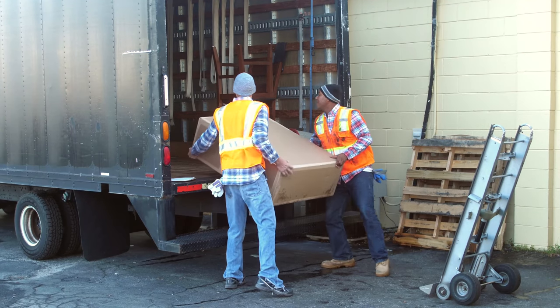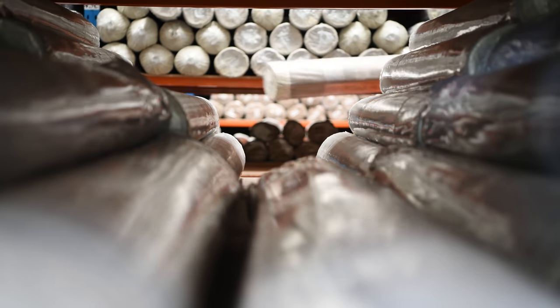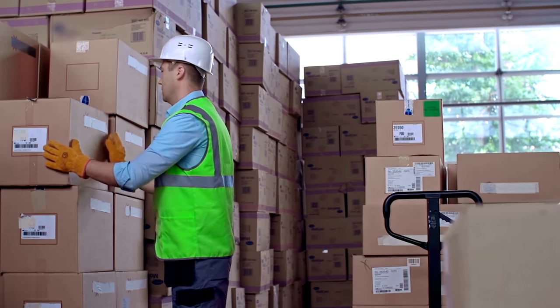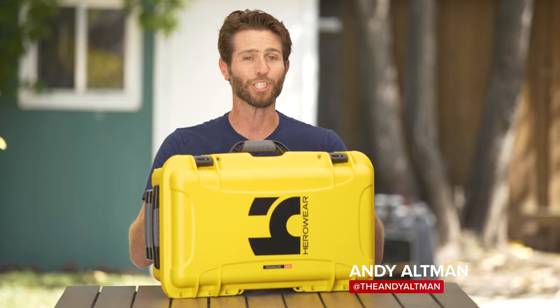If you're over 20 years old, chances are you've had a sore back at least once or twice in your life. There are millions of Americans that literally rely on the health of their backs to put food on the table every day. Inside this box is an exosuit built just for them.